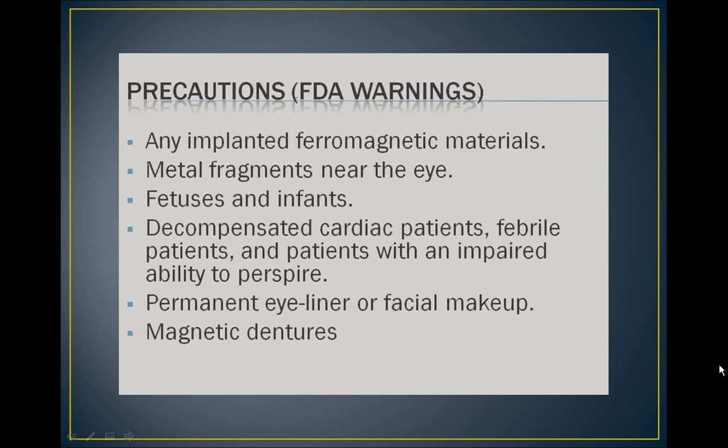Patients should be changed into a light hospital gown to avoid bringing any foreign objects into the scanning room. Some facilities just make a patient empty their pockets depending on what kind of exam is being performed. This could be a potential hazard because the patient may forget about something that's in their pocket, and it could become a projectile.